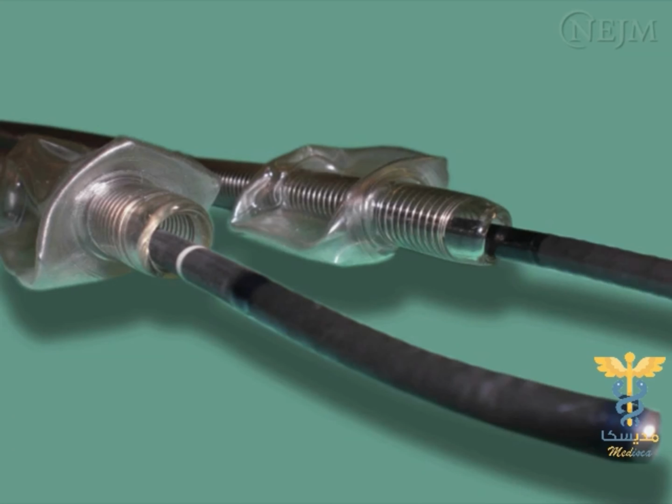It is very important to minimize the gap between the tube and the fiberscope, since a small gap decreases the likelihood of difficulty when advancing the tube over the fiberscope, especially in the posterior arytenoid region.